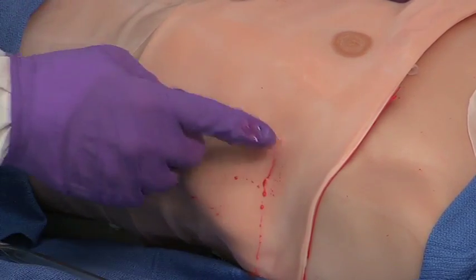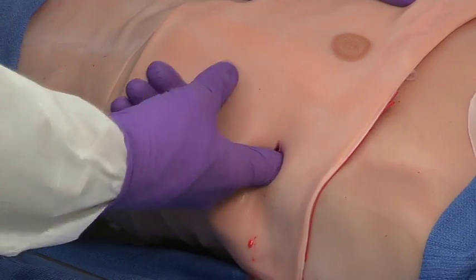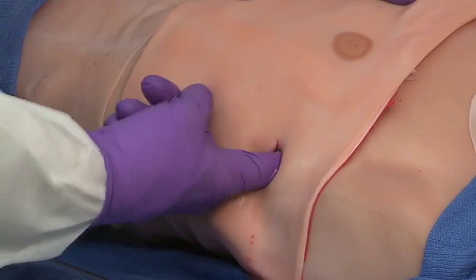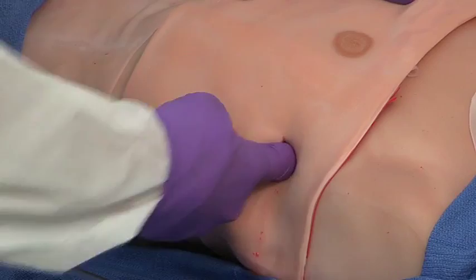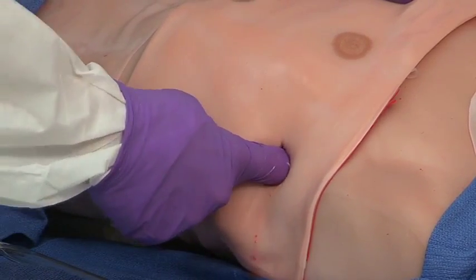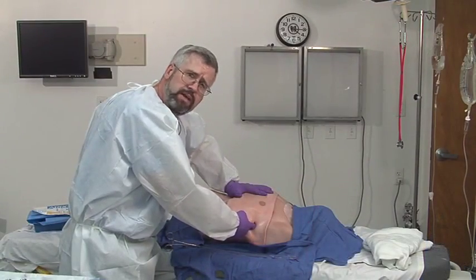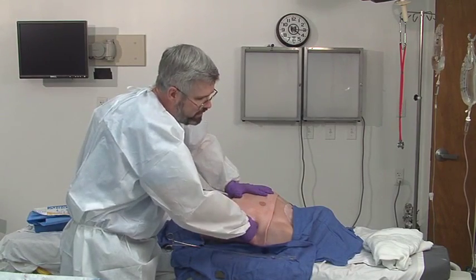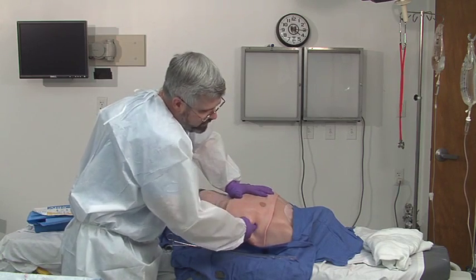The next step is to put my finger into the chest, confirm, number one, I'm in the chest. And in the patient, you should be able to feel the lung up against your finger. Also, the reason for putting your finger into the chest is to sweep your finger around inside the chest to make sure there's no lung adhesions with the lung stuck up against the chest. Because even if the patient has a pneumothorax, he can still have adhesions up against the chest wall, and you can cause additional damage to the lung if you don't sweep down these adhesions. So now we've confirmed we're in the chest. We can feel the lung under our finger.